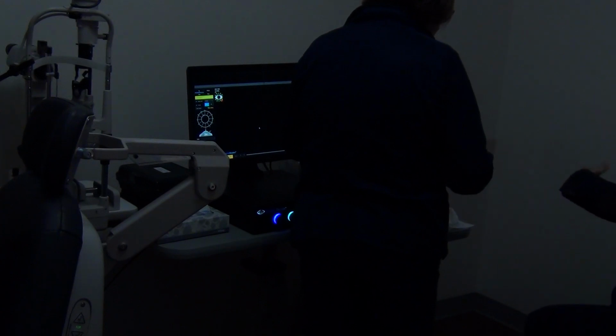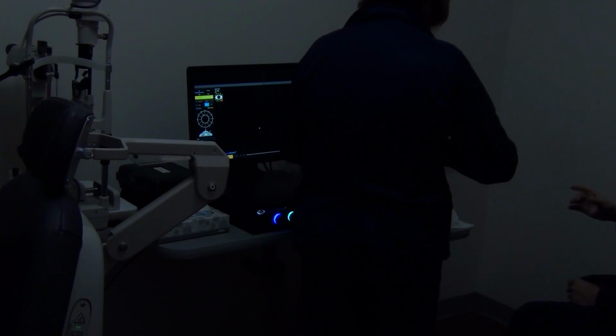But when you do it from the side, let's say the patient is laying down like this, right? Your screen should be here. You should be able to reach your gain if you need to. And again, you can do both eyes from the top of the head, so you're not really interfering with the facial part.